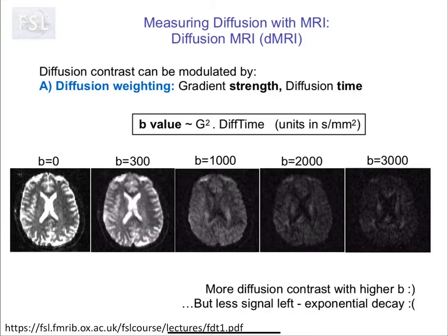Okay. So here's an example of b-values, and in most of the scans you'll be doing, there's always going to be a b equals 0 image. So this is essentially the image without additional diffusion weighting. Does it have no diffusion weighting? No, there's always some diffusion weighting because there's always gradients in your pulse sequence. But it has what we're calling minimal diffusion weighting, so we're calling this the b equals 0 image. The actual b-value might be 2, 3, or 4, but for all intents and purposes, we're calling it 0.